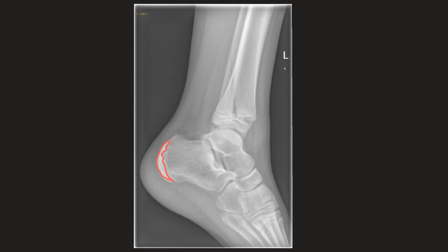When you look closely at the rest of the x-ray, we can see there is a fracture in the distal tibia, seen just here, going through the metaphysis and then going through the growth plate. So this is in keeping with a Salter-Harris type 2 fracture, which we said before was the most common type of Salter-Harris fracture.